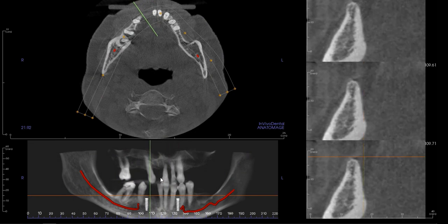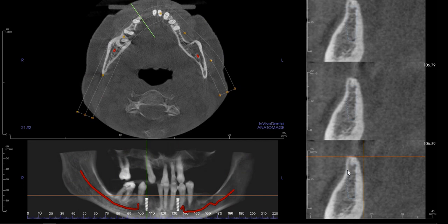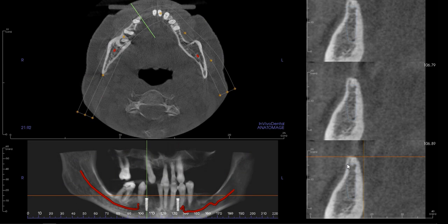So the B and D locations are correct — they're just a little bit more towards the midline than what you have here. The available bone we have here is good, but not great. I'd call it fair. The implant you placed here is definitely encased within bone, but the blood supply to the bone on the outside of the implant will be little to none based on the fact that this is cortical bone and not cancellous bone. Lots of implants exist like this and they're successful, but the more we understand implant longevity, the more we want a wider ridge with more cancellous bone around the implants. Misch has a whole classification on the edentulous mandible — I think he calls this a B/H ridge.